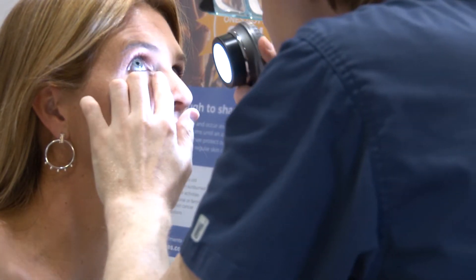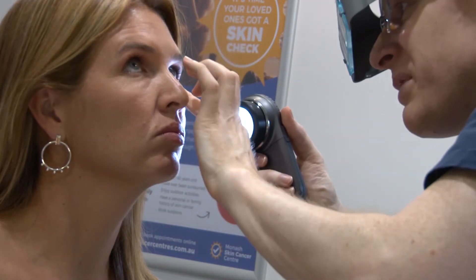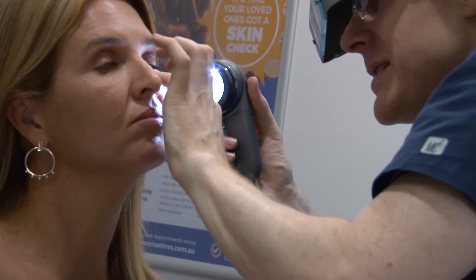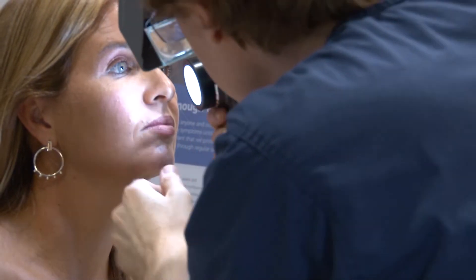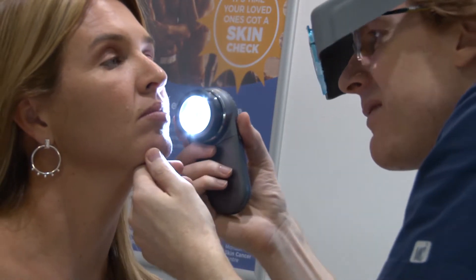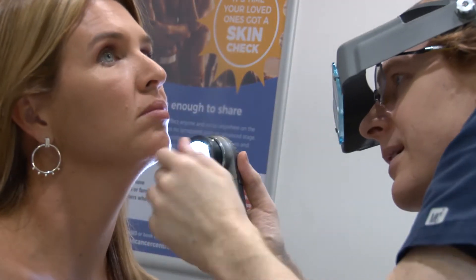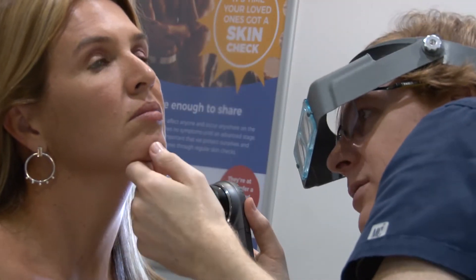Open your eyes and look upwards for a moment. This is all pretty good skin. A bit of freckling — why wouldn't you have a bit of freckling? Some people get rough bits on their noses because they've had so much sun over four decades. You don't really have that, so you've got good genes or good management or something. That's a normal mole. I'm trying to educate the patient as I'm looking for skin cancer — looking for pink things that have been in the same place for maybe six weeks and haven't gone away, and scaly things that haven't stopped being sandpapery in a couple of months. The face is a really common place to get skin cancer because we get lots of sun on it.